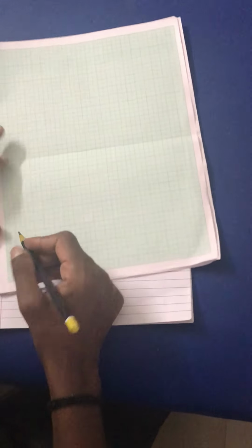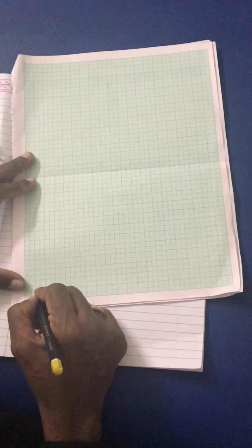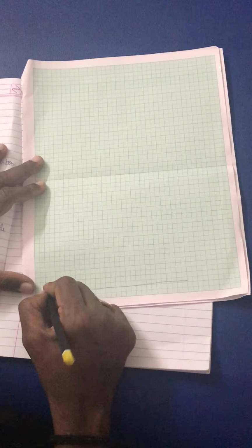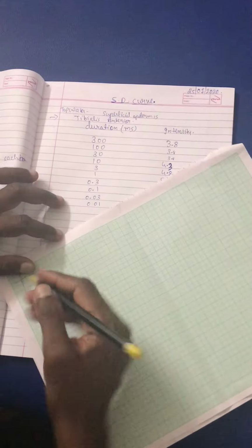So what I'm going to do is, can I have a pencil? Normal pencil. Thank you. So what I'm going to do is this. This is where I'm going to plot an SD curve. So this is your x-axis, and this is your y-axis.